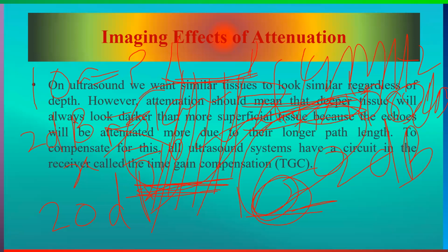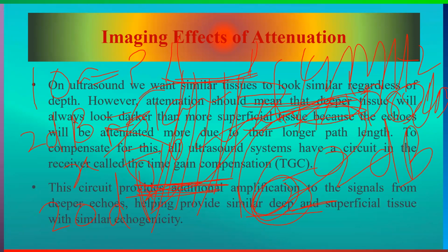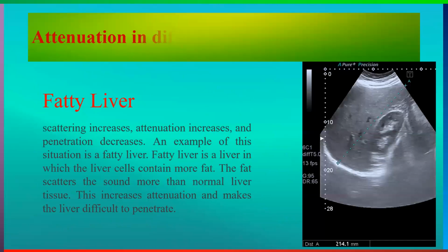So how will it be compensated? We are using time gain compensation for it, which is called TGC, right? TGC, depth gain compensation, DGC, or time gain compensation, TGC, will be used over here, right?